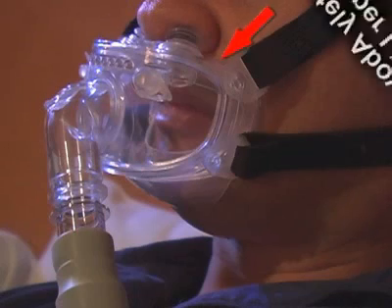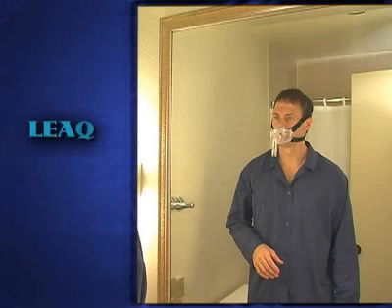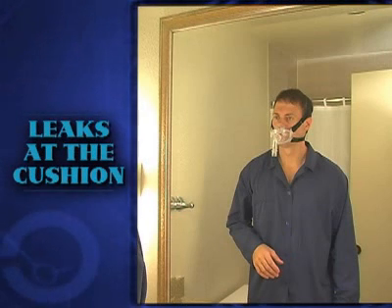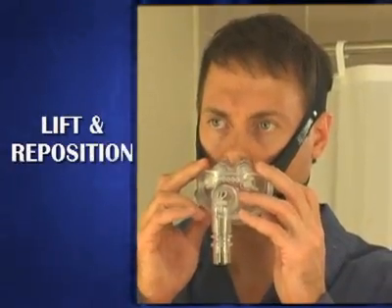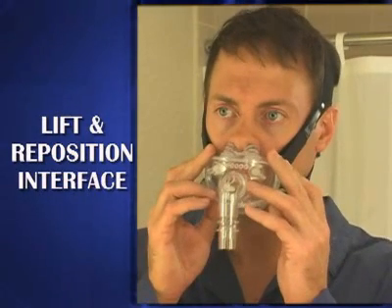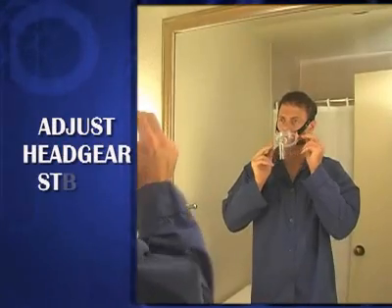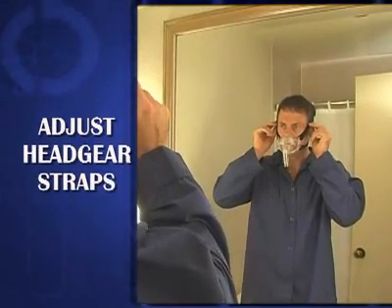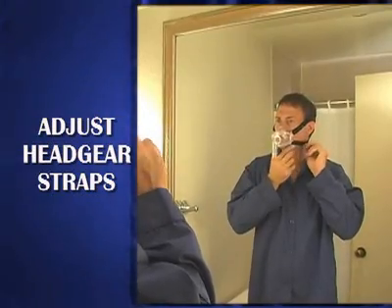Also, confirm that the upper section of the oral cushion is resting completely above the mouth on the upper lip. If you are experiencing small leaks around the oral cushion, lift the inner face slightly off the face and reposition. You may also gently pull on each of the four headgear straps, but be careful not to over-tighten as this may cause discomfort.